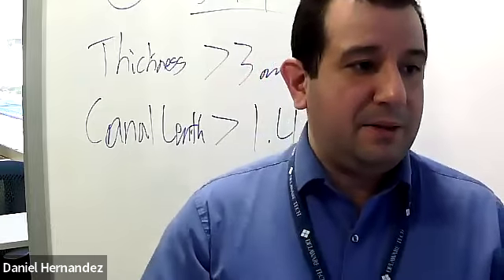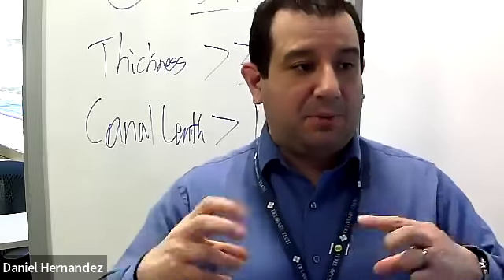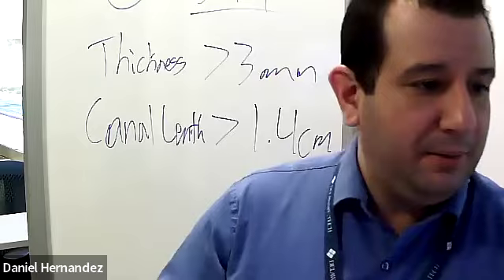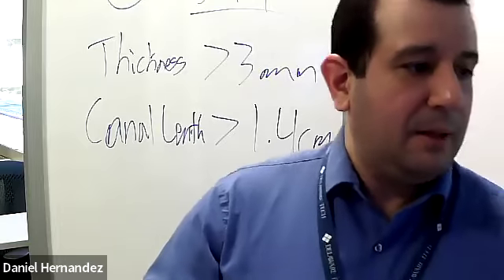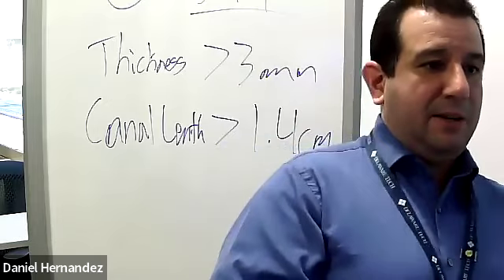With ultrasound, we can depict intra-abdominal fluid and potential abscess formation. There are going to be little gas bubbles that we see within the walls of the bowel. We might see some distension. Here we go, some necrotizing enterocolitis.